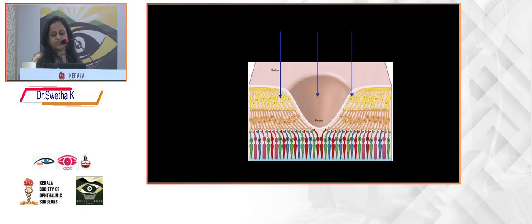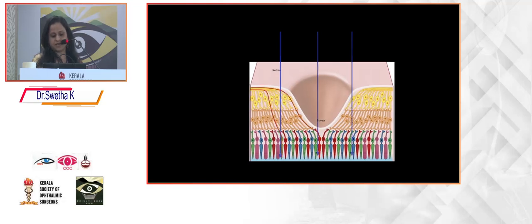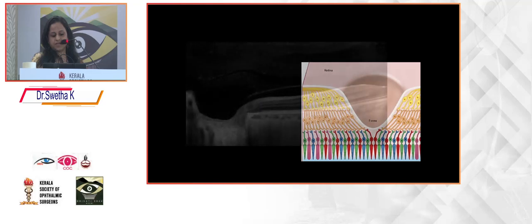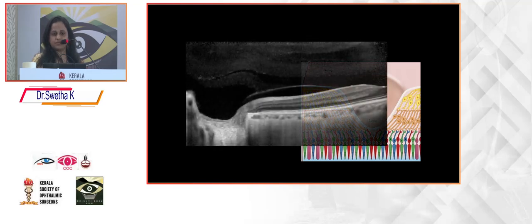Generally we know that the light falling on the retina goes to the retinal pigment epithelium, then goes to the bipolar cells, the ganglion cells, and then this forms the RNFL. So where we are interested is in the neuroretinal rim, the RNFL and the ganglion cell, all three together. This is where we have to focus in diagnosing glaucoma on OCT as well as detecting the progression.